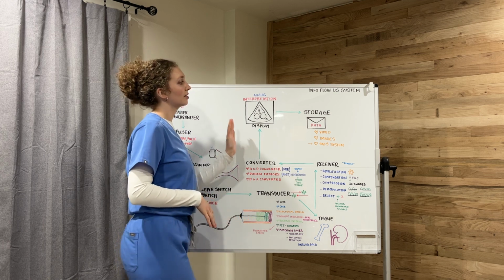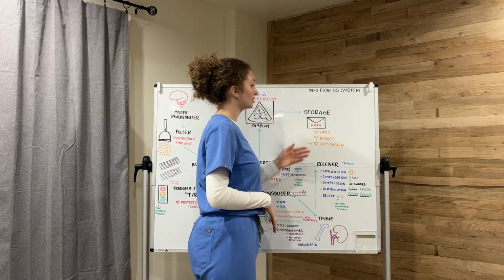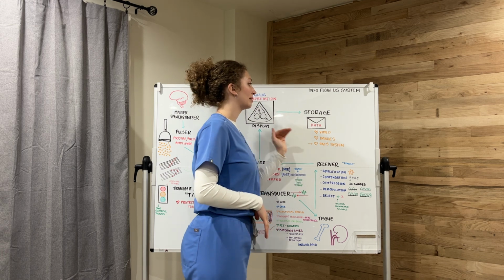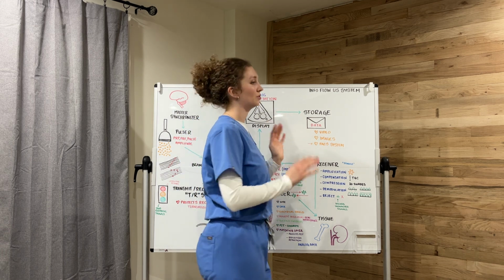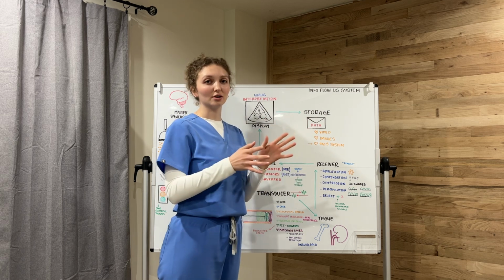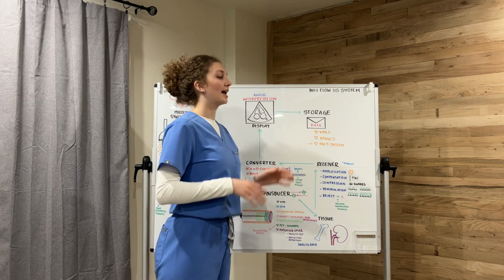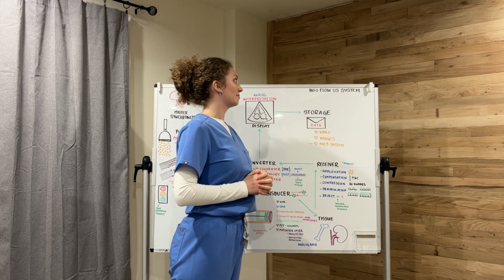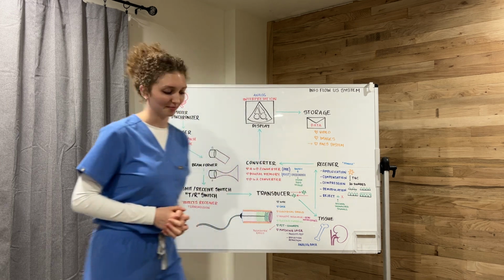And then from there, we have the storage, which uses a PACS system, which organizes the video and image data, which is then sent to other hospitals and doctors for further interpretation and diagnosing. And this is concluding my information flow in the ultrasound system presentation.